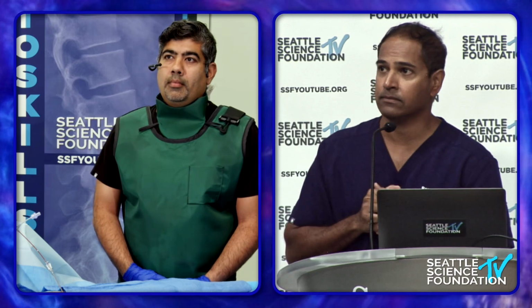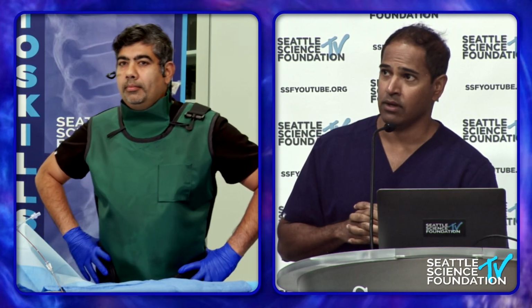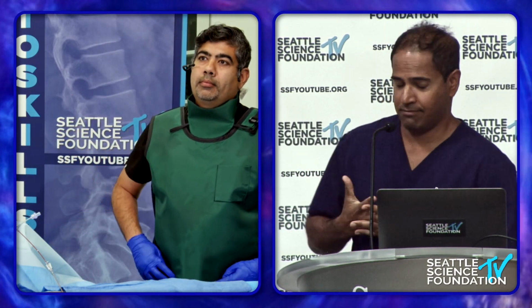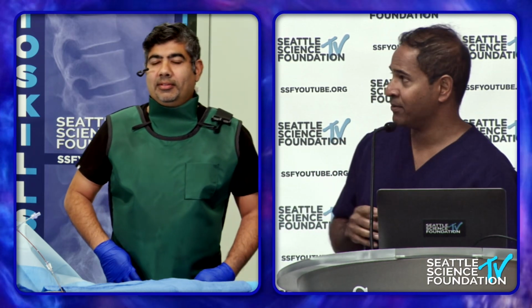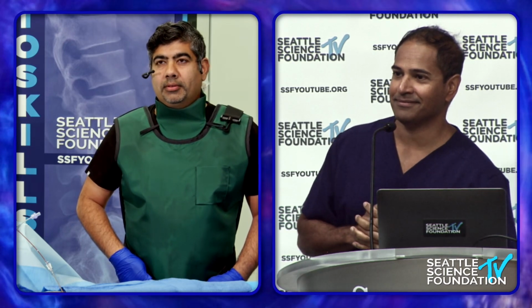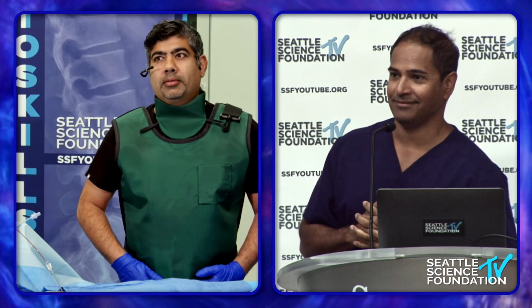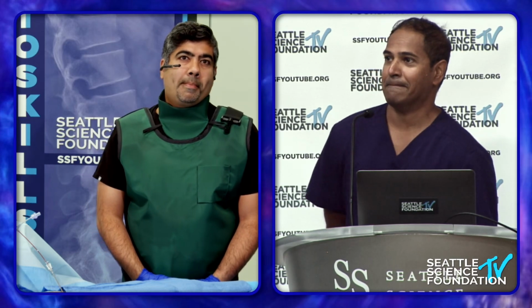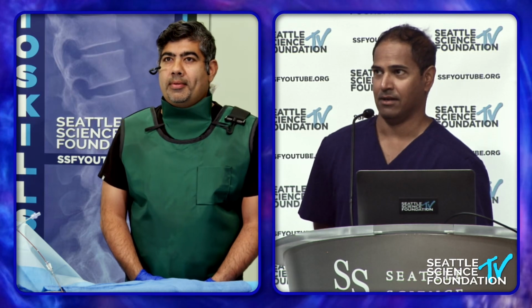Yes, another question. Do these patients undergo a trial protocol the same way SCS does? Yes, that's the simple answer. A trial, and then you can proceed as long as they have a 50% reduction. Yes, Ed. How do you pick between PNS and DRG for limb issues or peripheral neuropathy? And then secondly, do you consider foraminal stenosis before doing this procedure?